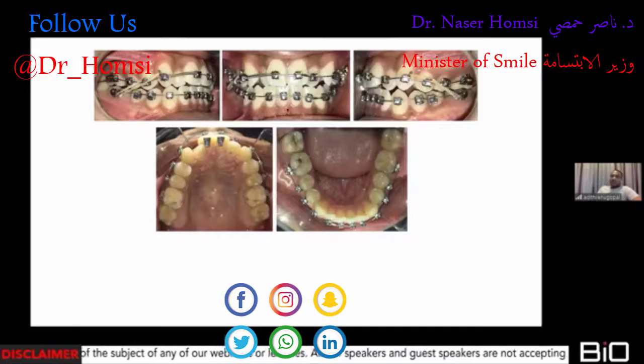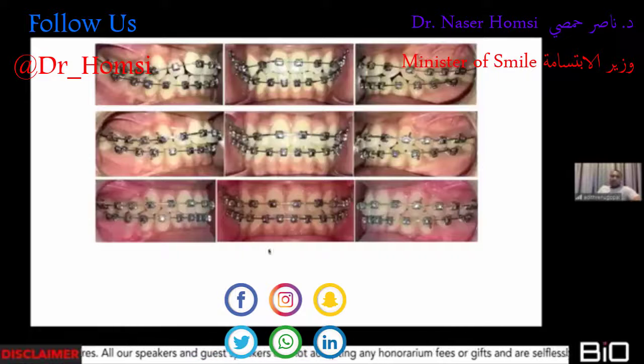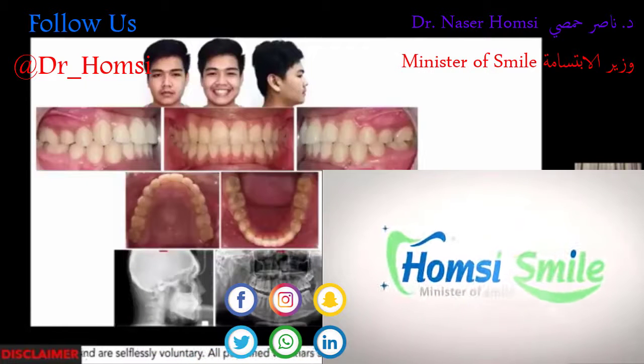So it's more of a diagnostic issue than an appliance issue in these cases. And as you can see, I was able to get a good amount of correction of the crowding. And I use the standard torque brackets. I do not use any high or low torque. But you can see the finish also is good.